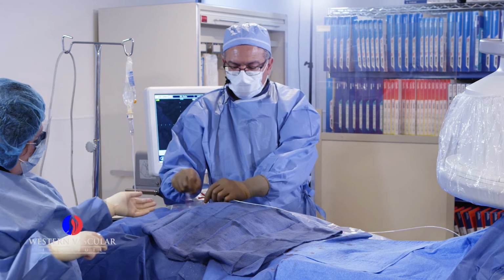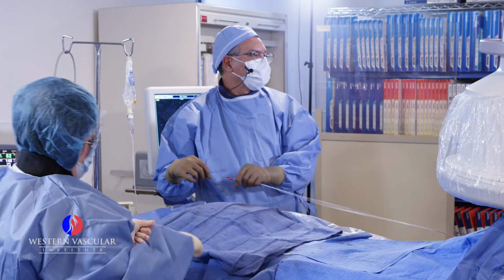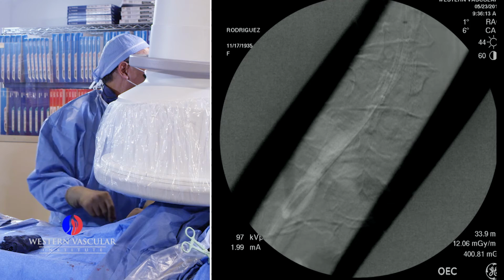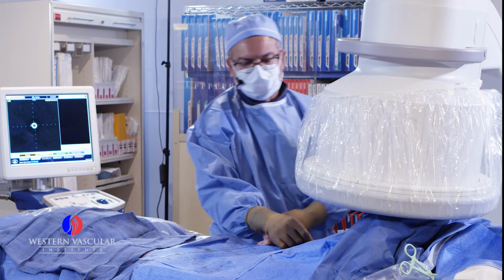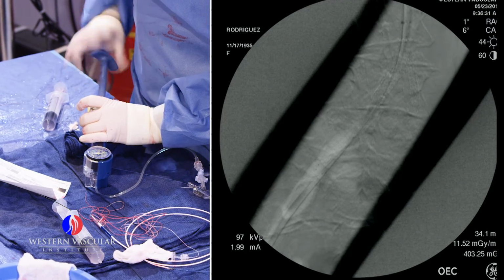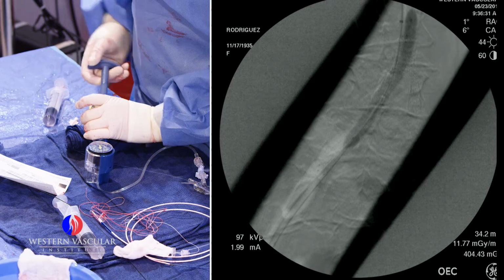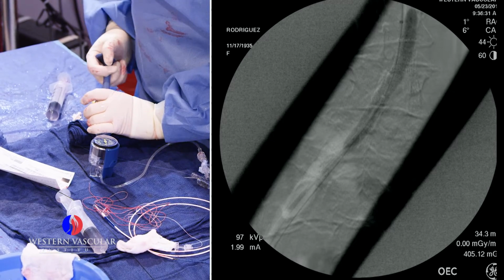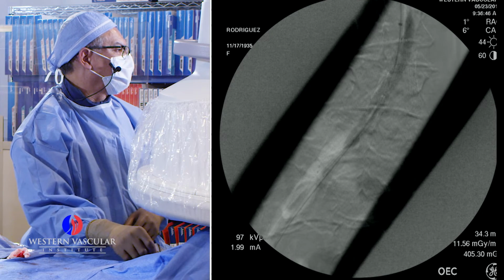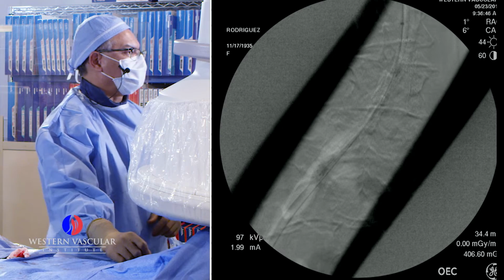So to make sure that we have a good opening, we're going to balloon this a little more, and we will do that from below. All right, here we go. Coming up. All right, let's dilate it here. So we're going to inflate the balloon up to 12 atmospheres of pressure. Here we go. Down. And then we're going to get the other end right here. Let's get to 12 atmospheres too.